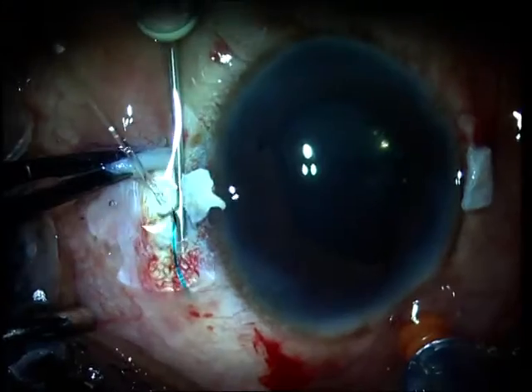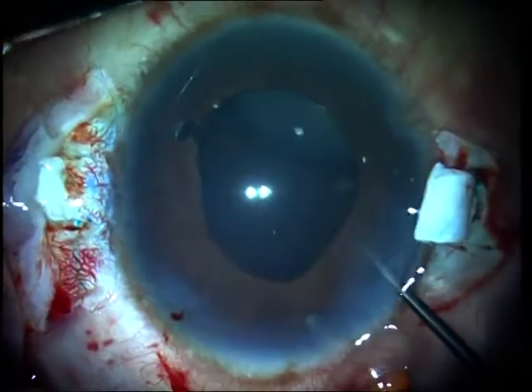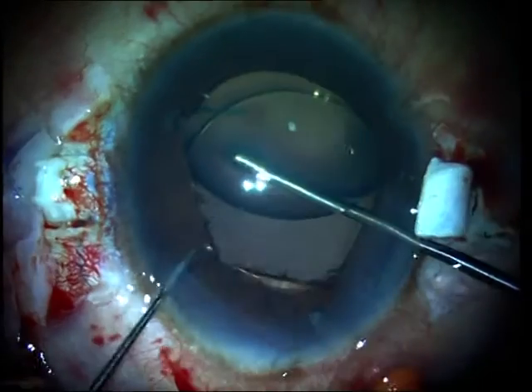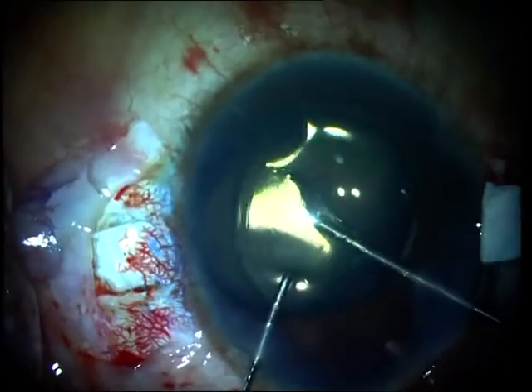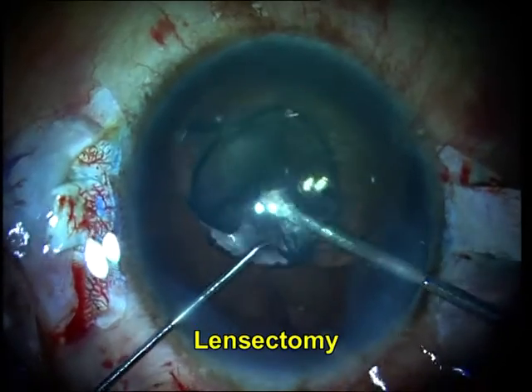I now tuck in both the haptics into the 26-gauge Shar-iath tunnels, and once this is done I have my glued intraocular lens acting as a scaffold behind the crystalline lens. I then go ahead and bring the crystalline lens out using an anterior levitation technique, and you can see that it's lying completely over the intraocular lens now.